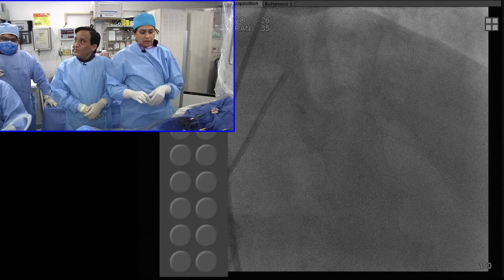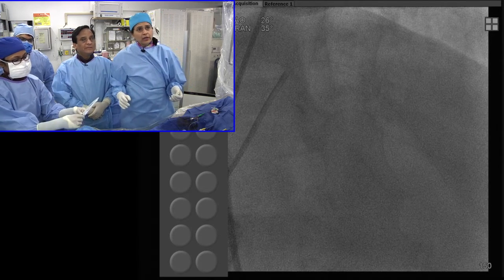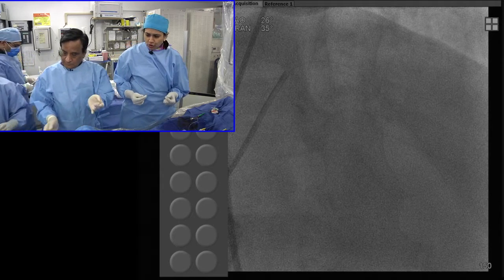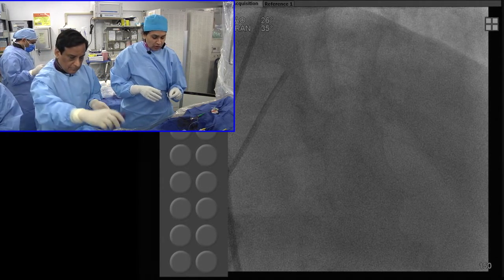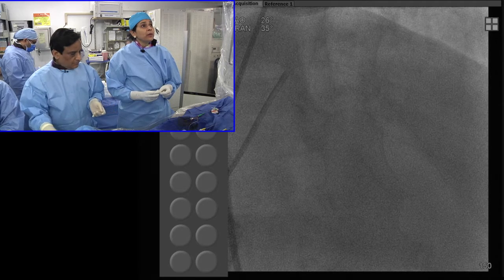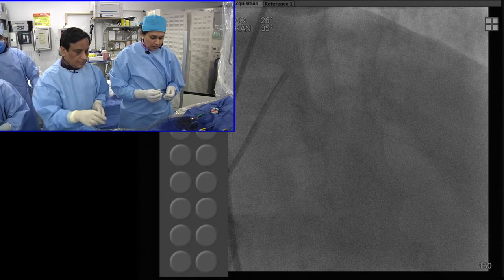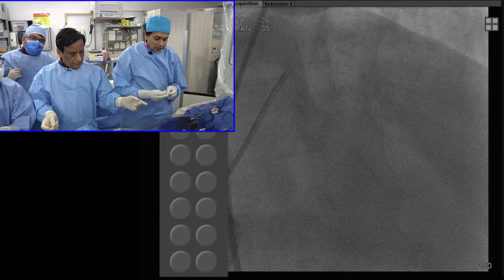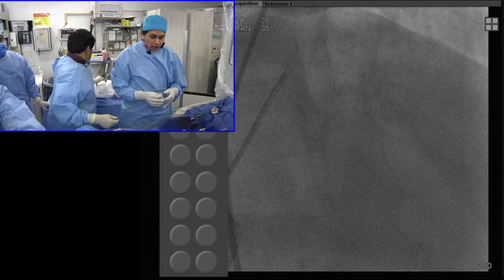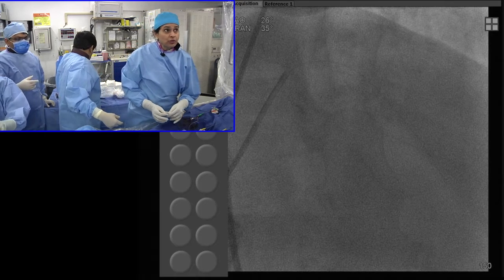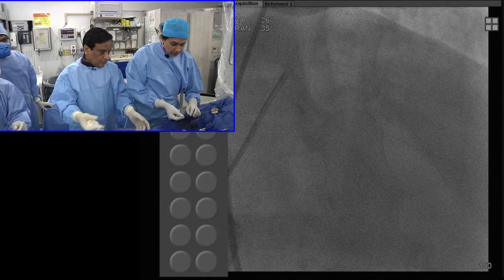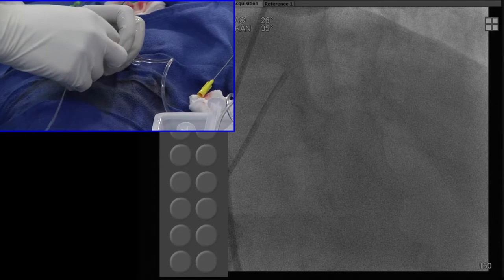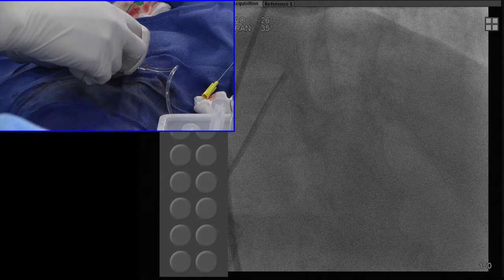We are ready to show the OCT. An important thing is what we have called co-registration — we have shown this before, but I want to highlight: we will be doing it with the cine angiogram. We will use dye and then co-register based on exactly where the lesion is, and you will see the OCT at that particular level.